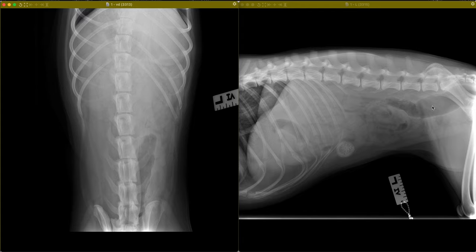The radio-opaque foreign material identified, with adjacent segments of distension, is very strongly concerning for mechanical obstruction. The segment containing the material with the associated distended segment does not follow the typical course of the colon. Given the rapid weight loss, partial obstruction with now complete obstruction would be strongly suspected. The foreign material could represent something like a nut or foam-filled ball, which might have initially functioned like a ball valve — potentially rotating to allow some food to pass — and has now completely turned such that no food is able to pass, resulting in complete obstruction.